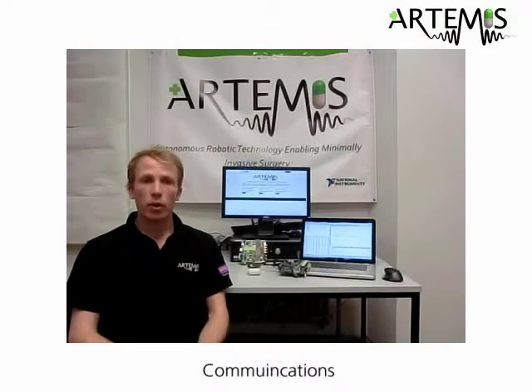Measuring the S21 parameter, which is the ratio of power received by antenna 2 and the power transmitted by antenna 1, we could determine that the attenuation is the lowest at low frequencies. Based on this test result, we decided to use 433 MHz as the operating frequency for the through-body communication link in this project.